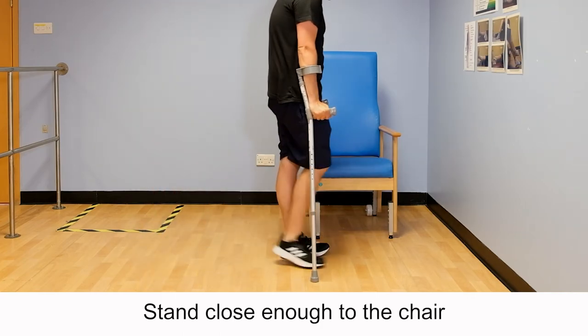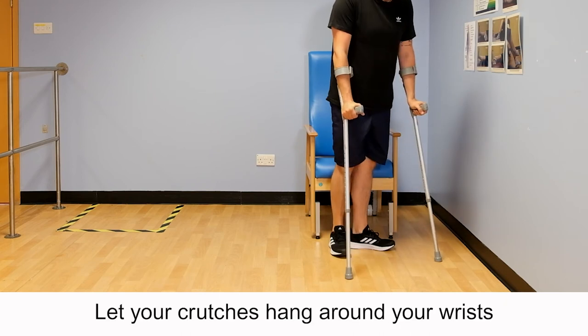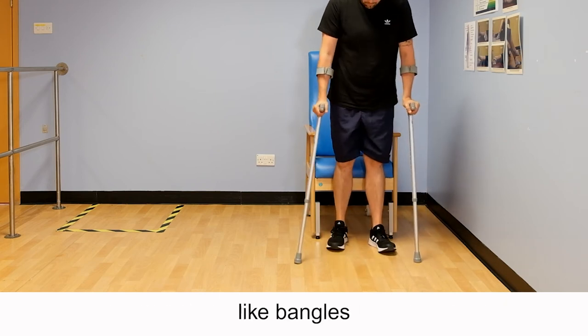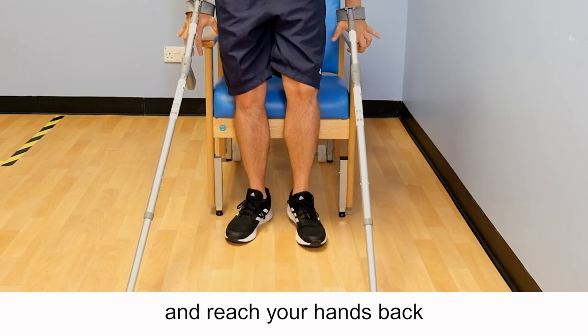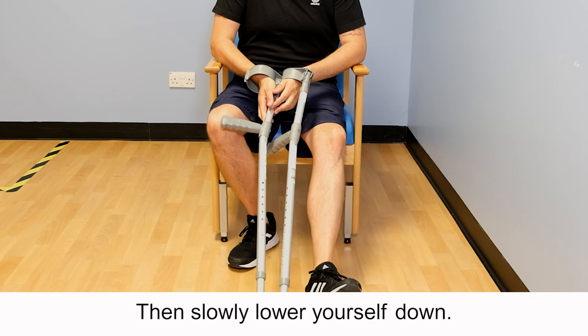When sitting down, stand close enough to the chair so it is in contact with the back of your leg. Let your crutches hang around your wrists like bangles, reach your hands back for the arms of the chair, then slowly lower yourself down.